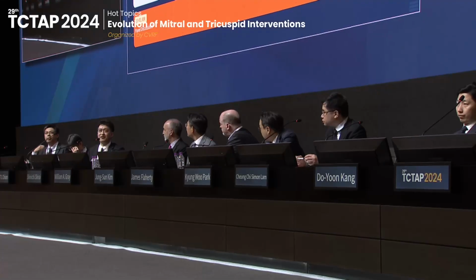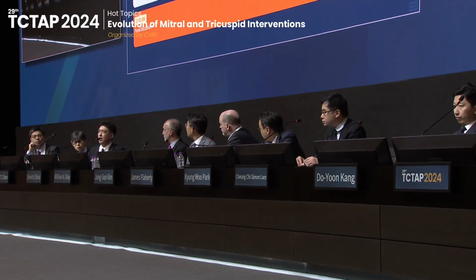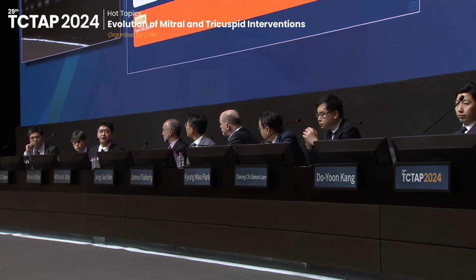Yes, so now we are still searching, because the device was only introduced recently, last year in December, and only for degenerative. In Japan, 70% of the mitral clip indications are functional regurgitation, and degenerative is less than 30%. So now we are searching for the differences and what the most appropriate anatomy is.